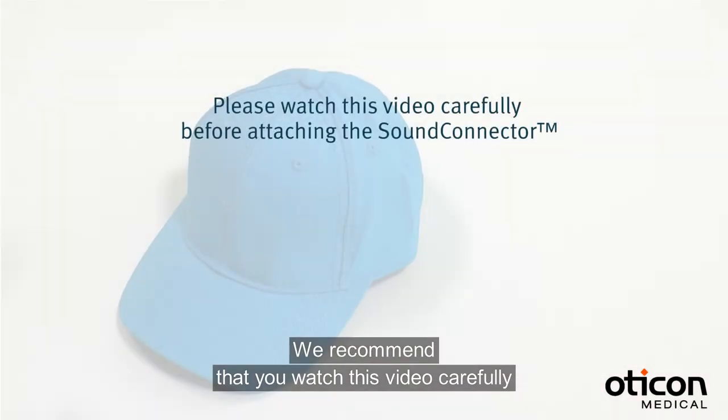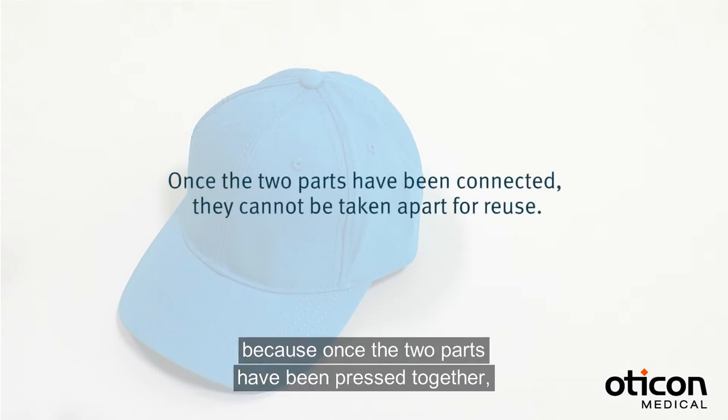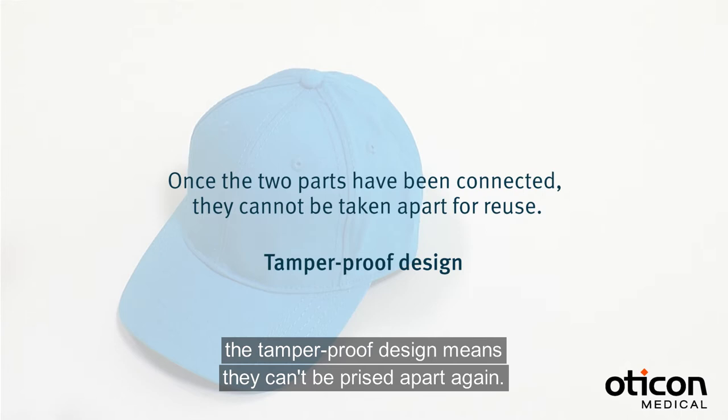We recommend that you watch this video carefully before attaching the sound connector, because once the two parts have been pressed together, the tamper-proof design means that they can't be prized apart again.